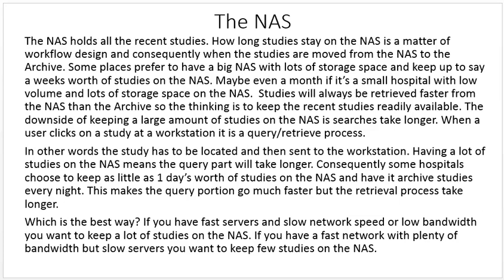How long studies stay on the NAS is a matter of workflow design, and consequently when the studies are moved from the NAS to the archive. Some places prefer to have a big NAS with lots of storage space and keep up to, say, a week's worth of studies on the NAS. Maybe even a month if it's a small hospital with low volume and lots of storage space on the NAS. Studies will always be retrieved faster from the NAS than the archives, so the thinking is to keep the recent studies readily available. The downside of keeping a large amount of studies on the NAS is searches take longer.